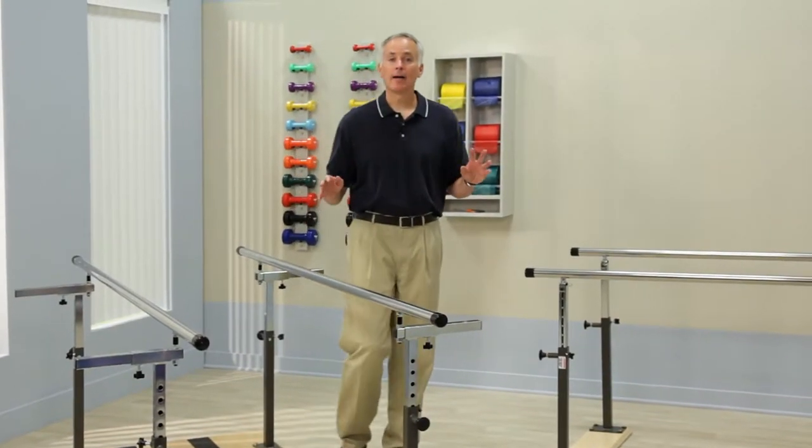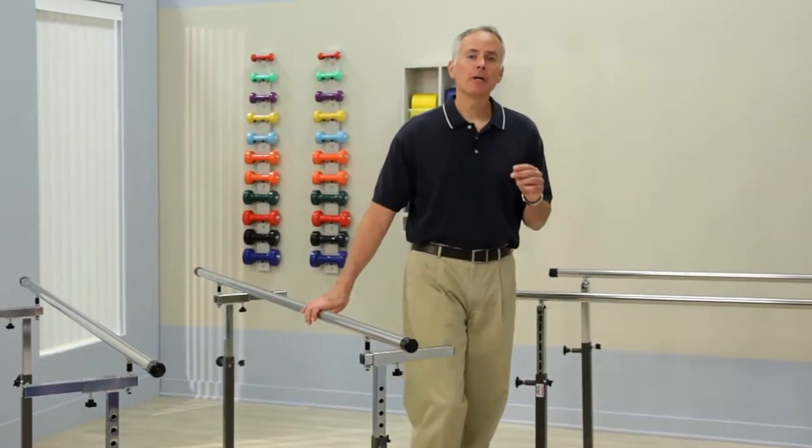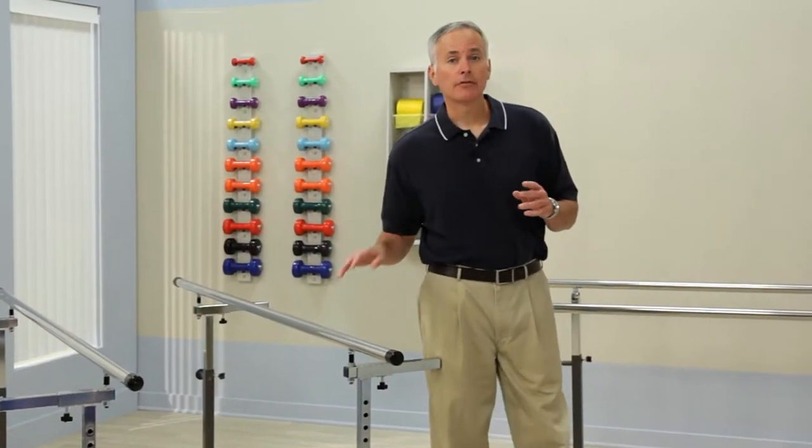While most people's idea of parallel bars comes from gymnastics competitions, parallel bars play a much more serious role in the lives of many people both young and old every day. Parallel bars used for physical therapy is serious business, and designing and building them right is Clinton's business.